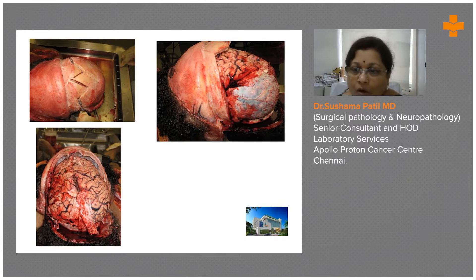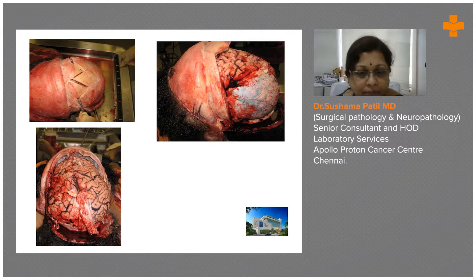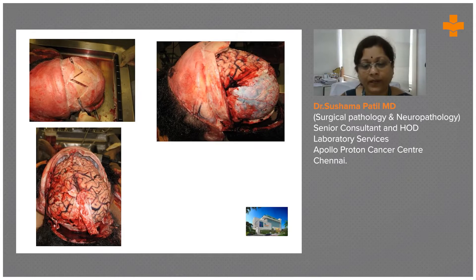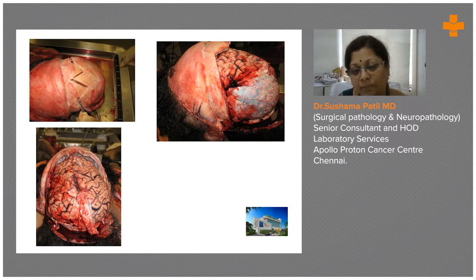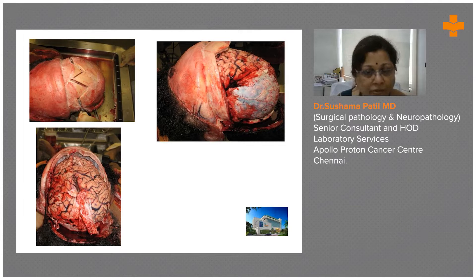Here we have taken the whole dura out and you can see the entire brain is exposed. Once the dural support is removed, the weight of the brain is such that it starts falling down — you can see some space here because it is coming behind on the head end of the person as I was taking the brain out.